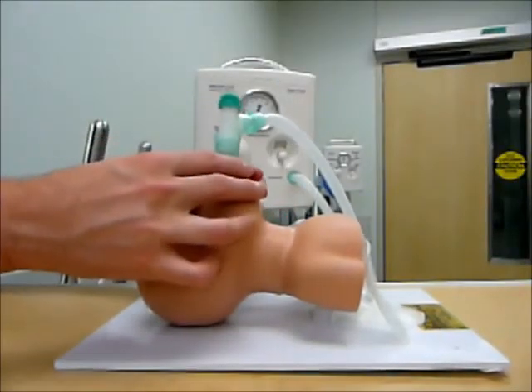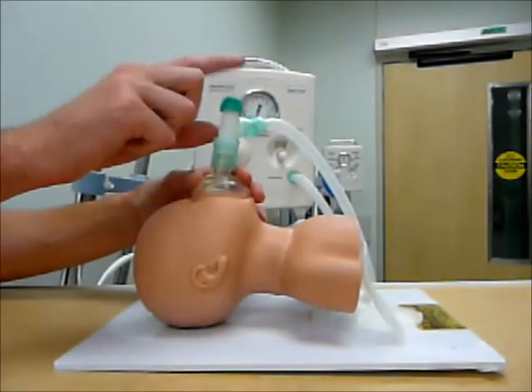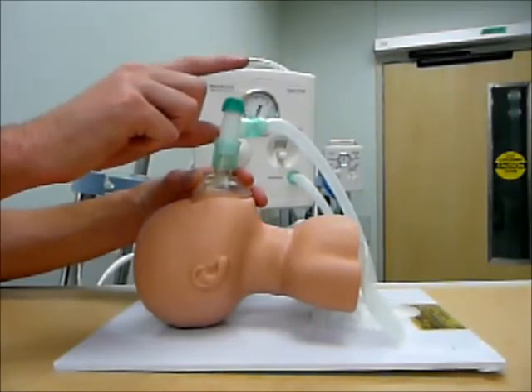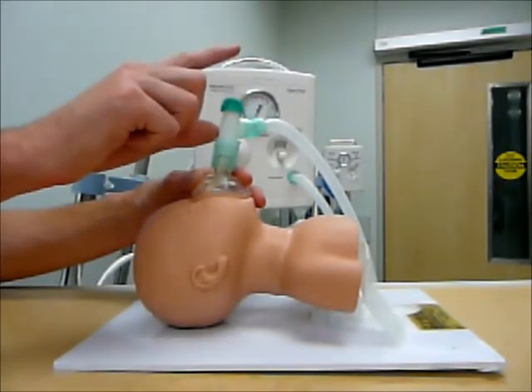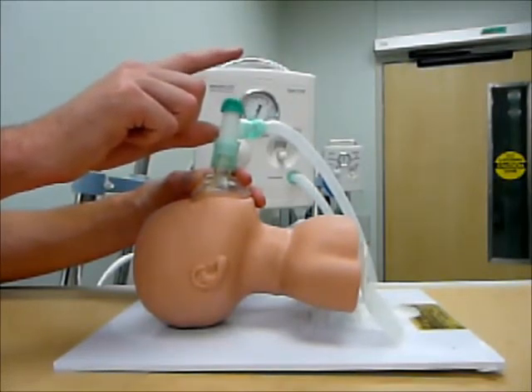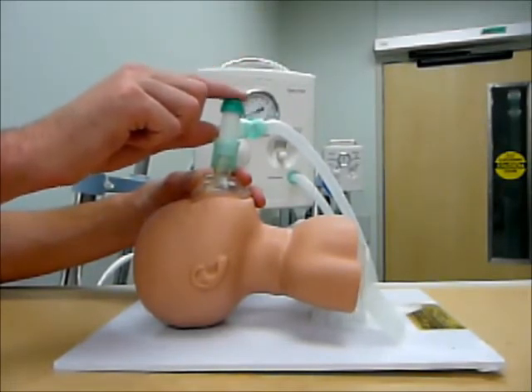Next, if I did want to go ahead and provide ventilation to my patient, while having a nice good seal I am going to occlude the top. When I occlude that, all the flow of gas is going to go down to my patient and I am going to end up going up to my peak inspiratory pressure. Just hold it on for a second — if you hold it on for a long period of time you are going to be giving a prolonged I-time to an infant, which you do not want to do as it can cause harm and damage to the lungs.